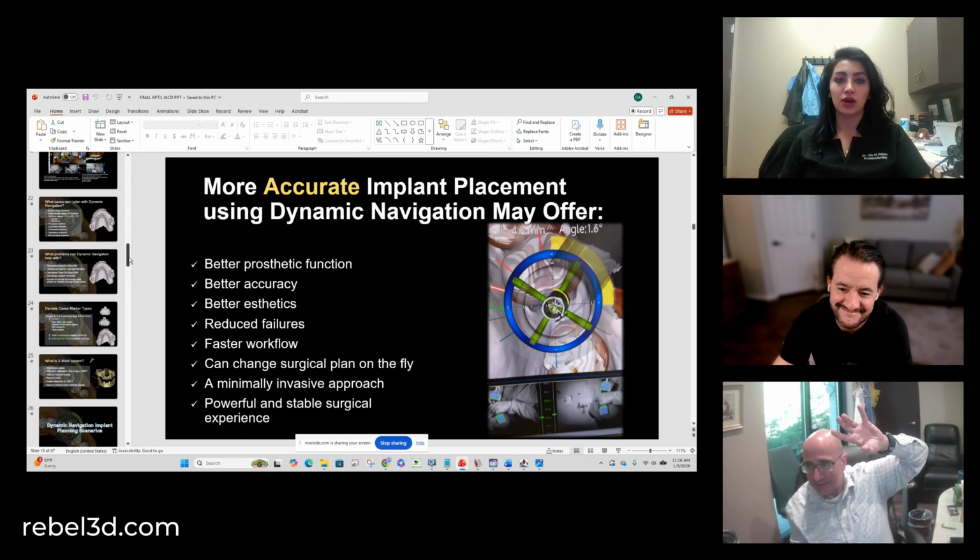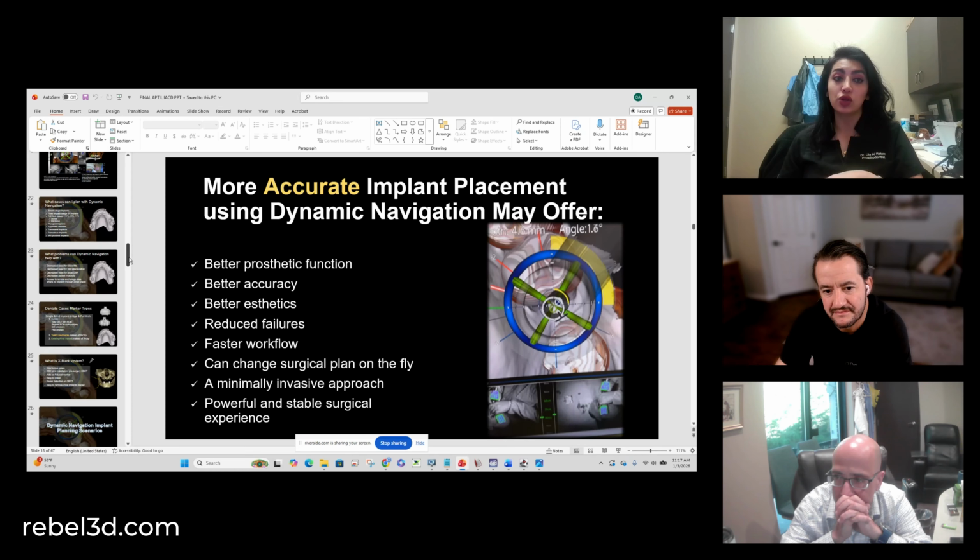So for the design part, of course, when it comes to record collection, I highly advise all clinicians to get the records themselves. It's fine if you delegate scanning the jaws, but you have to be the one who actually determines: is the bite good where it's at? Does it need to be open? Do you need to close the bite from the get-go? Yes, there are actually some cases where you need to close the bite from the pre-op, so you have to take it to exocad and do the closure there.